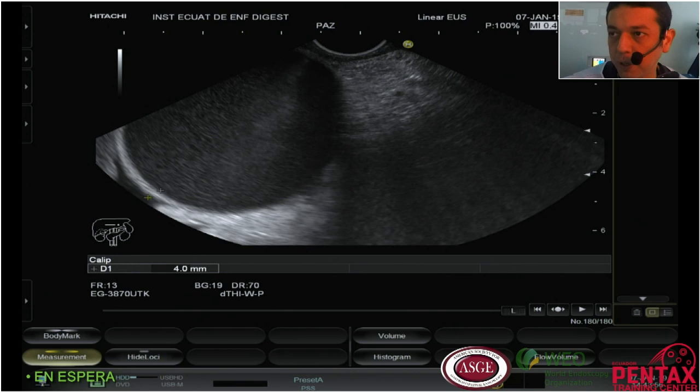This is the first case of the year. It's a very interesting case today.